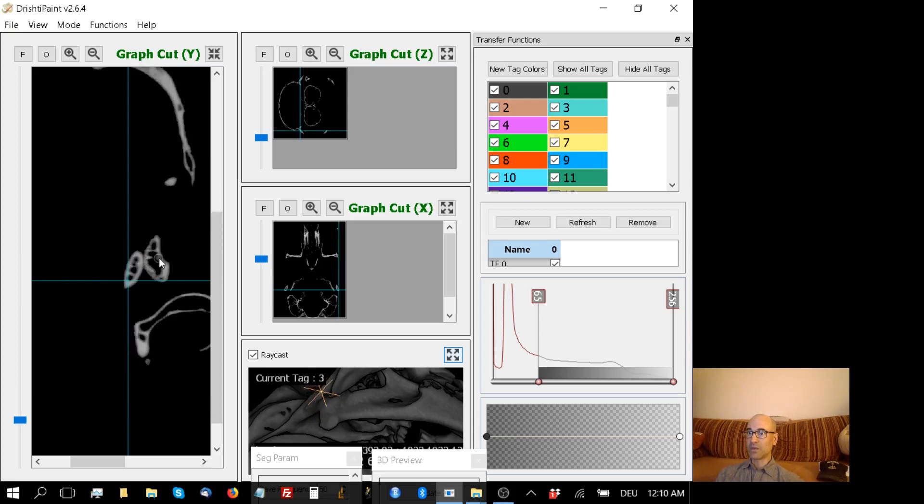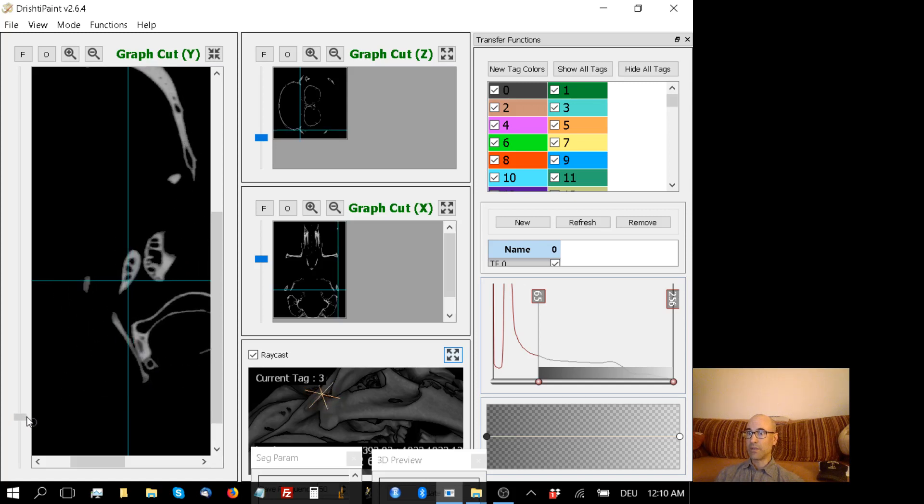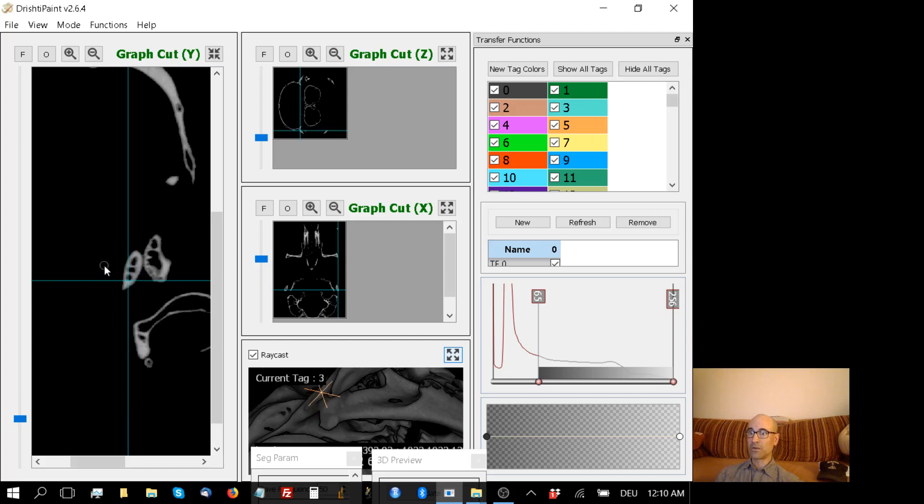So what I want to do, this is dentary, right? And then this here is squamosal on that side. And I want to color all of the squamosal tag 1.